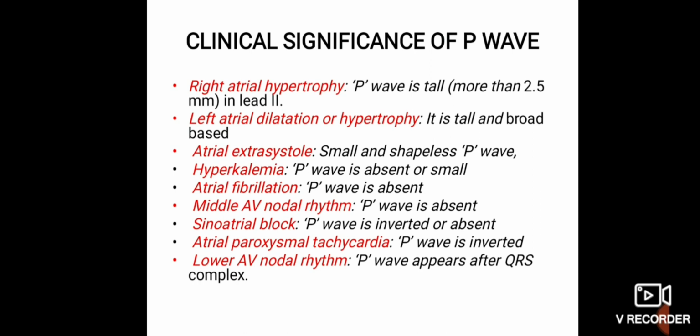Sometimes the ECG waveform shows arrhythmia, where people have deviations, prolongations, elevations and absence of waveforms. It may be due to the P wave or T wave or interval elongation. These are some of the arrhythmia conditions I have added here. Mainly atrial fibrillation, where the P wave won't be present because the atrial muscles are fibrillated.